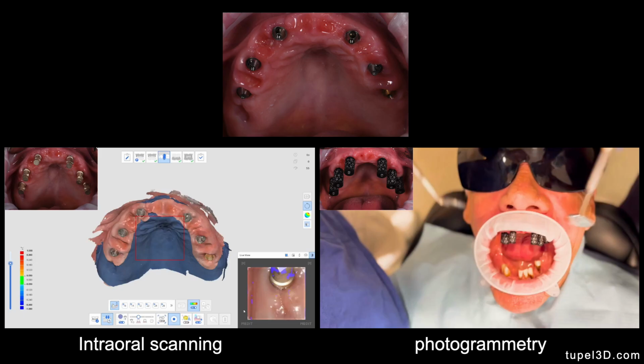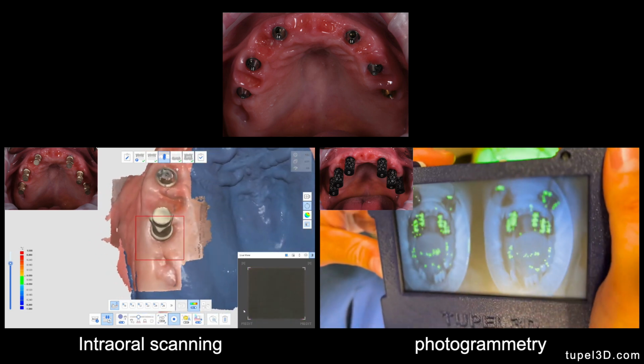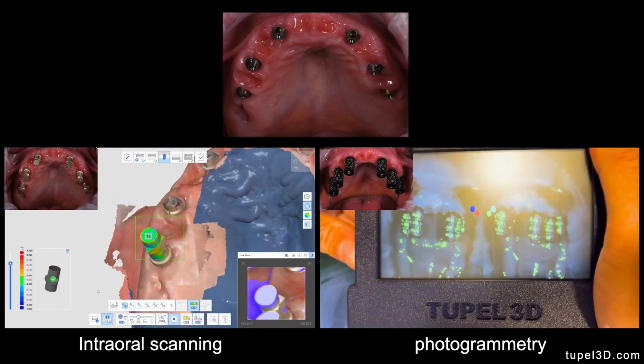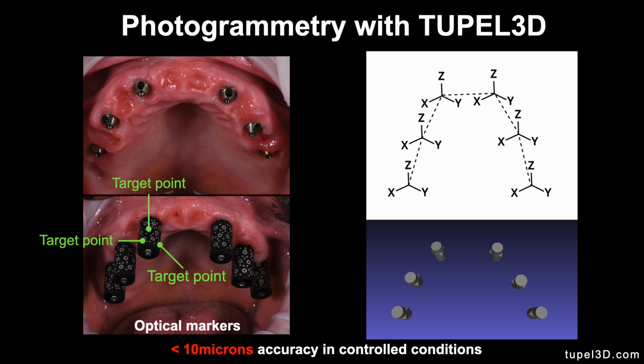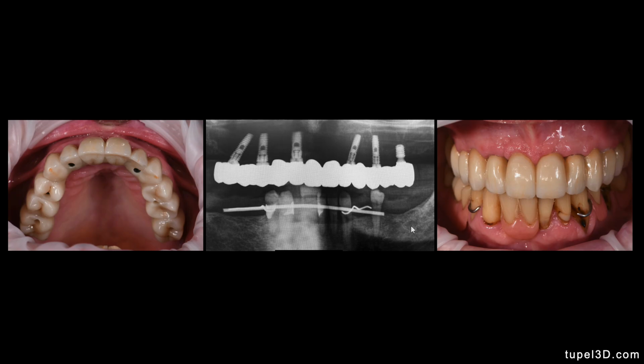Okay, and I'm going to show you how it works. If you compare with the intraoral scanning, the device is basically an extraoral scanner that can capture the exact position of the implants only, disregarding all the soft tissue, because the soft tissue will be captured by the intraoral scanner. When you obtain the photogrammetry data, you can see that you have just the position of the implants floating in air, and the accuracy of the position of the implants is less than 10 microns. Then you align the photogrammetry data with the intraoral scanning, and you can construct a very passive final implant bridge.